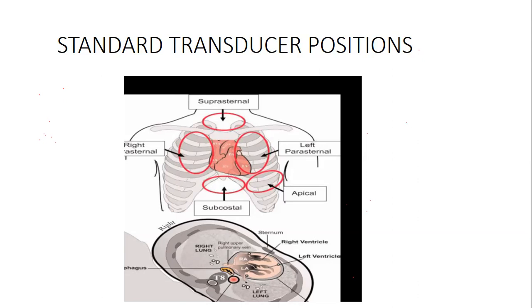So you find that I've used a curvilinear probe, which is not a cardiac probe. So you turn your probe. You let the pointer of that probe point to the other side. That's when you can pick the best or the acceptable oriented structures.